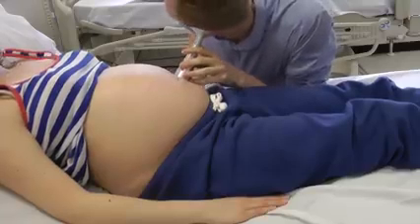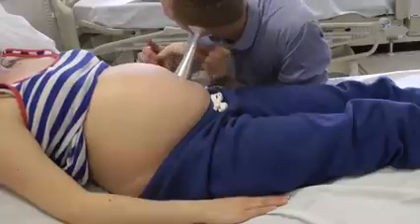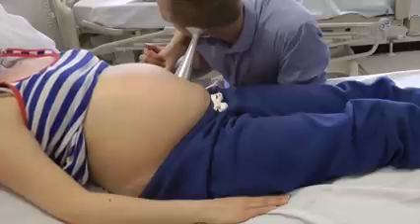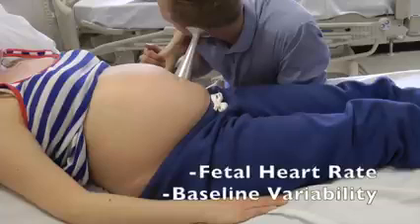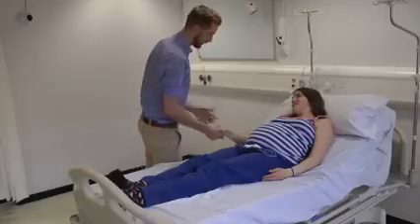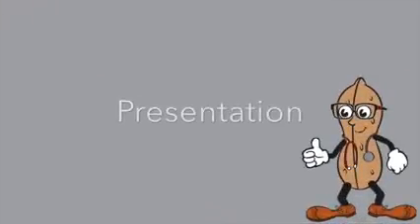Place the stethoscope in the correct position. Hold it in place with your ear so not to muffle the sound with your hand. Take the lady's pulse at the same time to ensure you're listening to the fetal heart rate. You are listening for rate and variability. You may wish to use a Doppler at this point. This completes your examination. Thank the patient and cover her up.